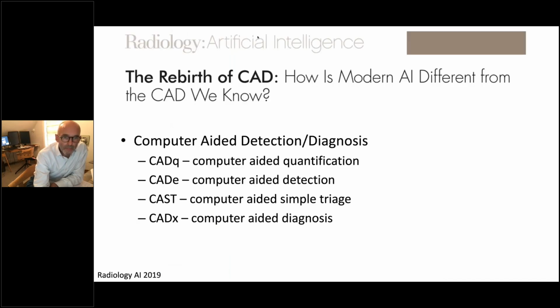We've covered this. Brendan mentioned this already. The one that everybody thinks about is computer-aided diagnosis. That's whether doctors are able to, and I say doctors, it doesn't have to be doctors, and I'll come to that in a minute, people able to make a diagnosis more readily using artificial intelligence.